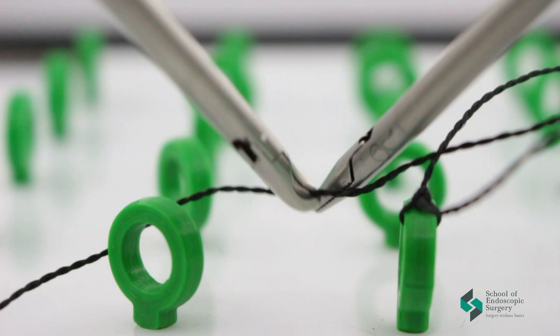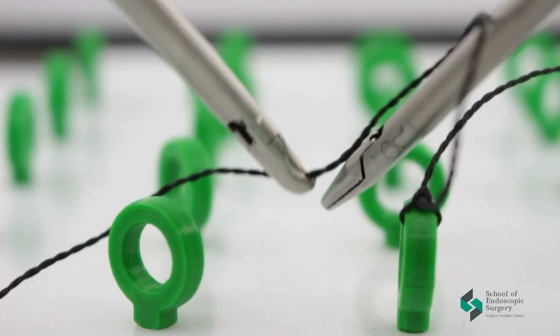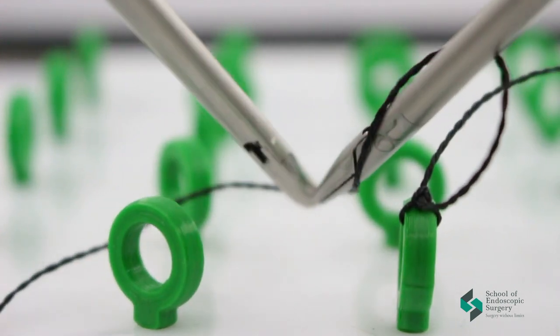The second step is forming a knot with the instrument you use to hold the thread. Try making the knot with the other hand.